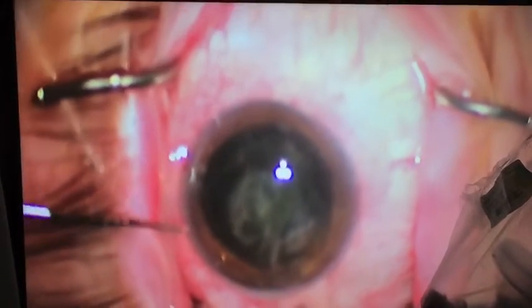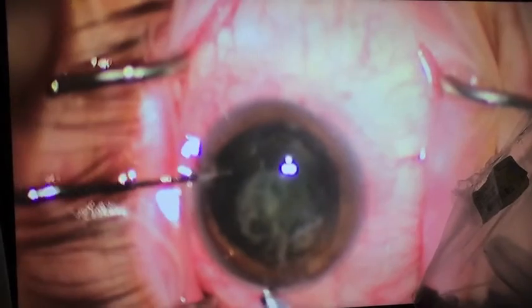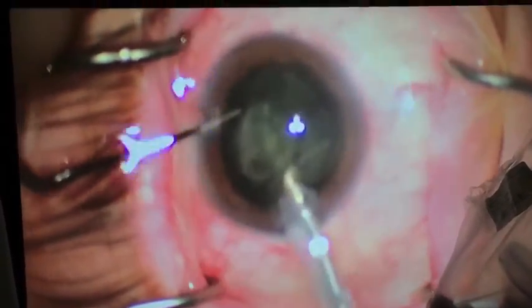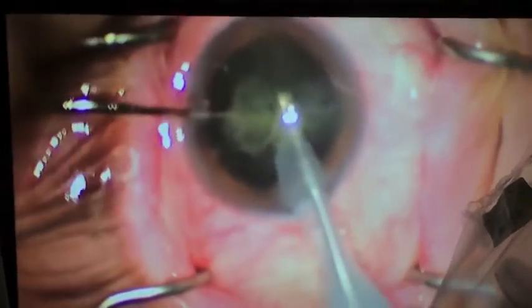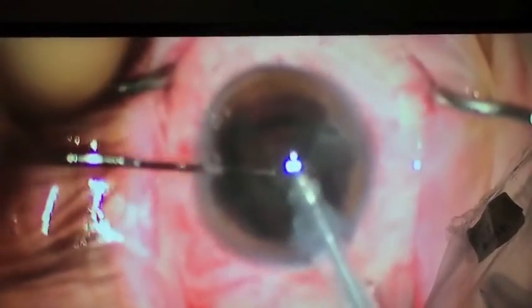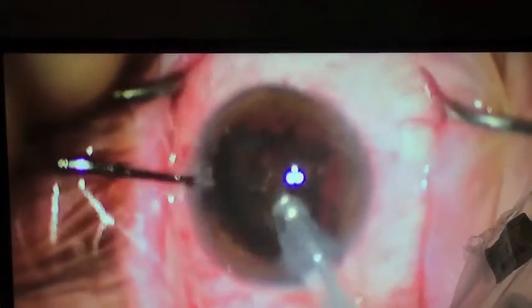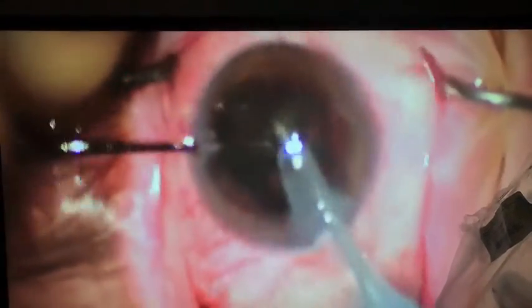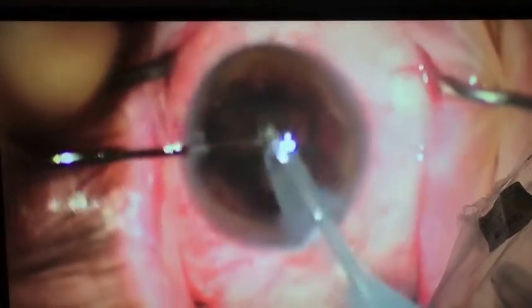Once we've disassembled the lens, we can use water and vacuum to remove it. The major change here is we're not going to use any ultrasound. Traditionally, ultrasound is used to disassemble and remove the lens, but studies have shown that eliminating ultrasound leads to better results. Here you can see me using water and vacuum to remove the cataract.